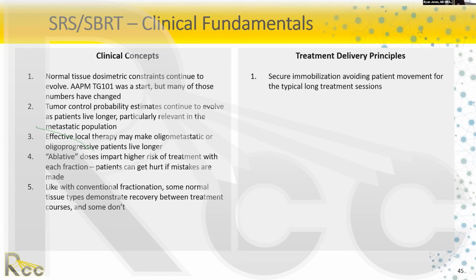Secure immobilization is absolutely essential to make sure they don't move for what can be very long treatment sessions, depending on your machinery. So, for example, where I work now, when I came into this market, they are very fixed on arc-based, essentially mostly coplanar arc-based SBRT. So it's VMAT, volumetric modulated arc therapy. And these treatments are quite short. We can get a prostate fraction done in just a few minutes.